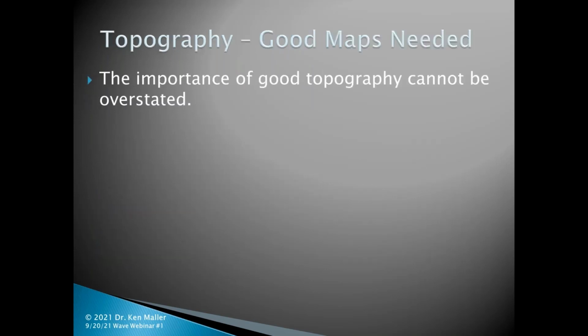All right, so let's start with the maps that we're going to take for topography, and I cannot stress this enough. Good topography is vital to you getting a lens that's going to work properly. The lids must be out of the picture. Lids change the data that's processed, and you may or may not pick up on the way that the data is being changed, but guaranteed WAVE will pick up on it and deliver a lens that does not fit properly. So make certain that lids are out of your picture.